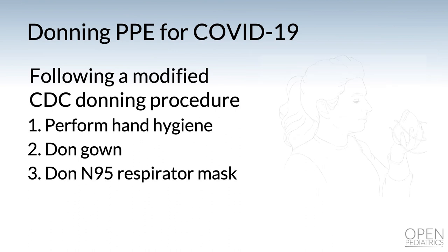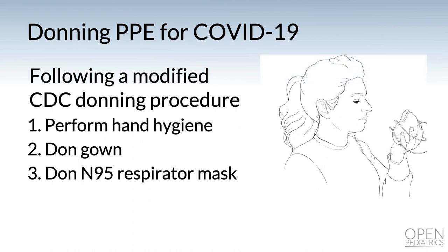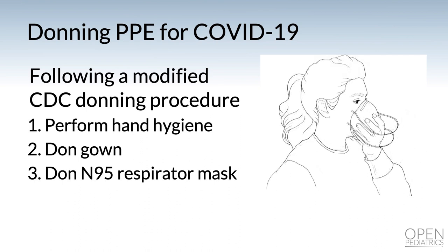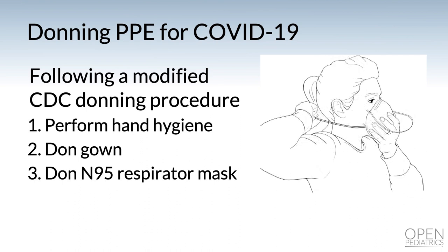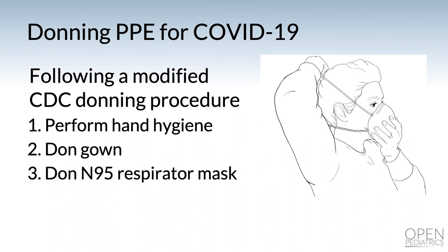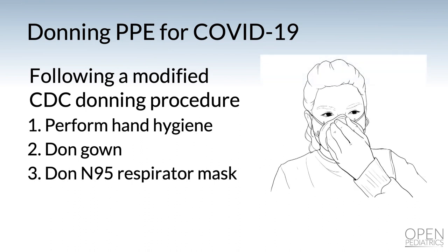Next, don the N95 respirator mask. Hold the mask in position, placing the bottom strap at the middle of your neck and the top strap at the middle of your head. Fit the flexible band to the bridge of your nose, then do a fit test by placing your hands over the mask and assessing for leaks around the edges — make sure it fits snugly to your face and just below the chin. Avoid touching your face during this step; just touch the outside of the mask, because your hands are dirty.